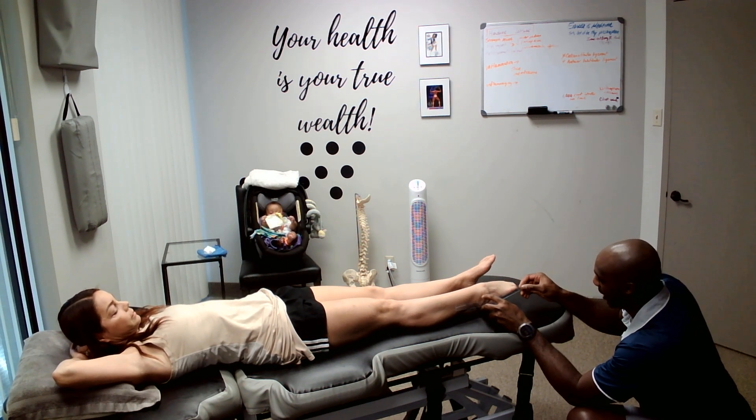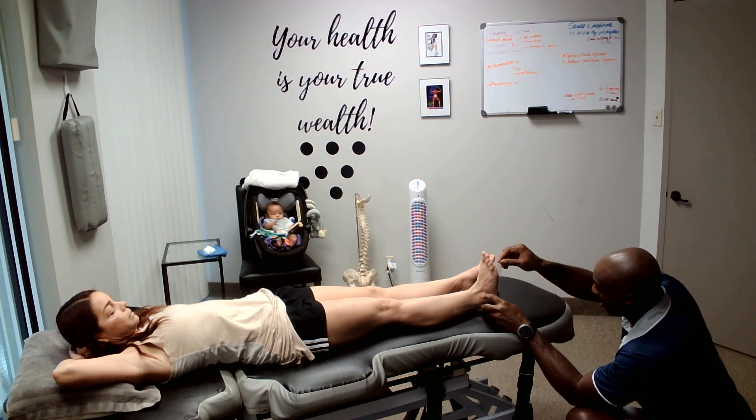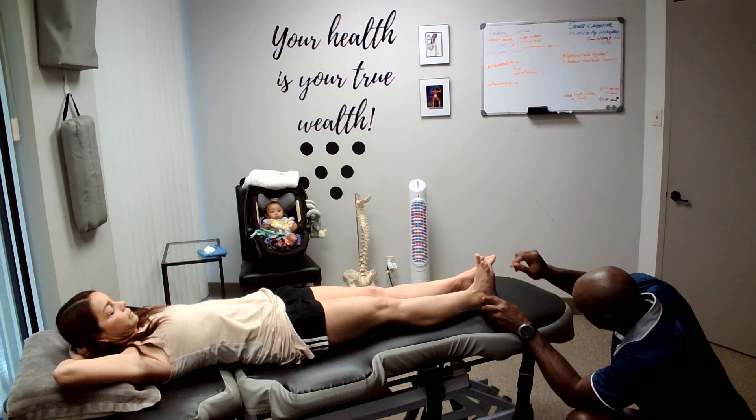Go ahead and point this one down. This is the third one — I'm going to follow you, so go ahead and go slow for me. We're going to have that parallel. That's about parallel right there.